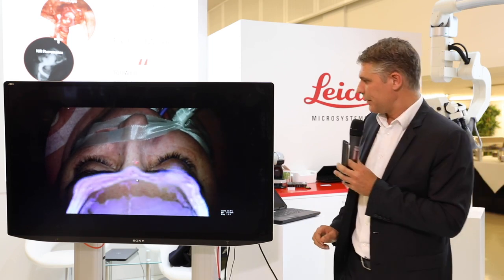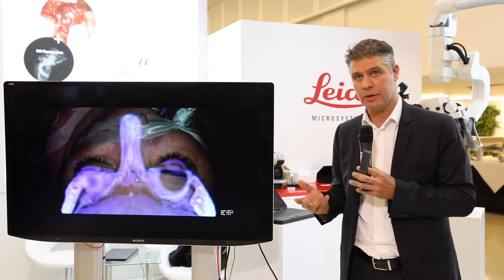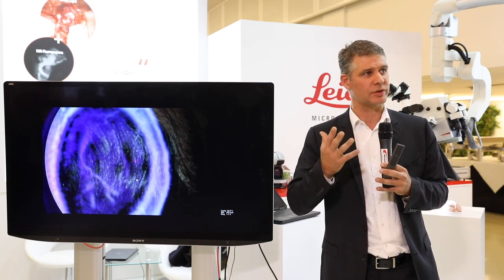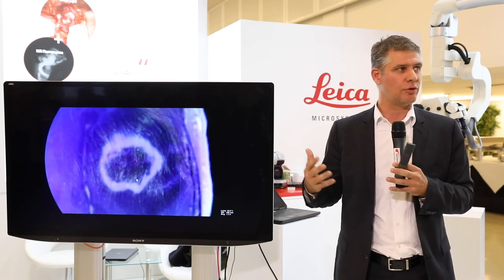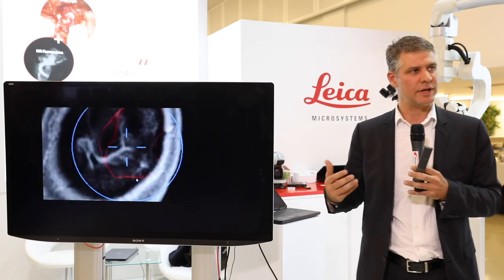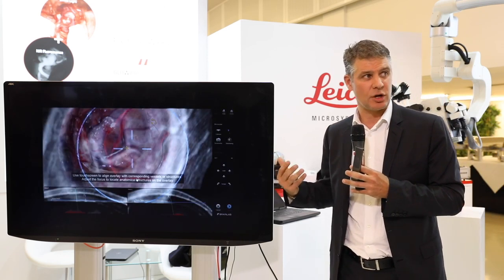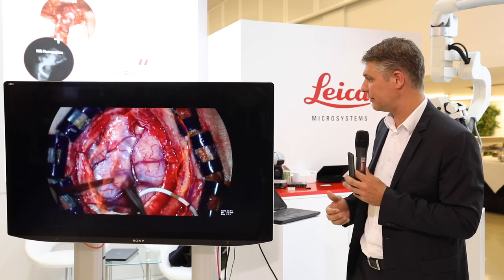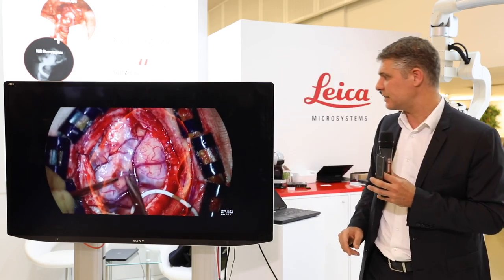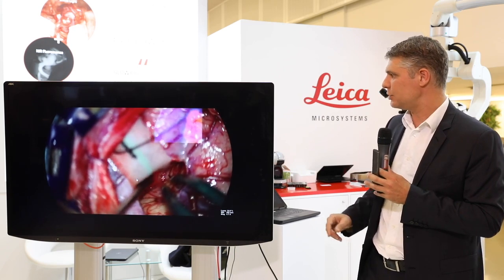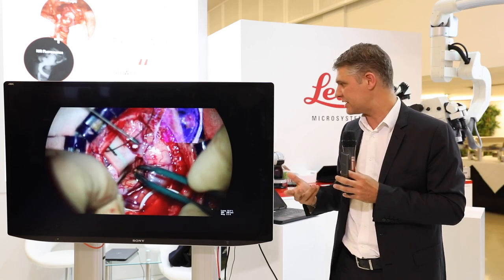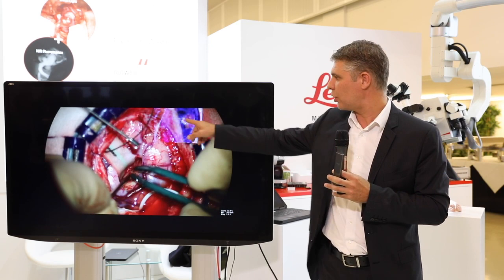This is another example where we didn't have time to prepare, so we use the MIP images to scan and see how well everything is adjusted. We don't have a segmented face — we use the real raw data and scan through. We can see the tumor is on the edge of the ventricle. We use one vessel as a signature vessel, and then another vessel deeper to re-register precisely, so we know where the tumor is according to those vessels.